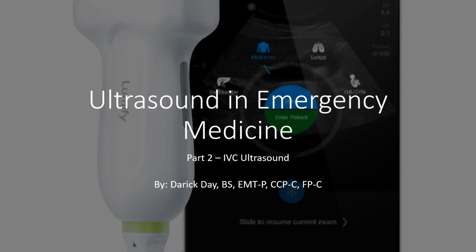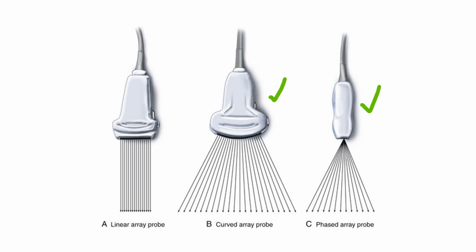Okay, so this video will be the shortest of the point of care ultrasound videos. We're going to go over performing a basic IVC ultrasound and how we can utilize that in our sick patients. For this one, we're going to want to do phased array or curvilinear. IVC obviously is deep, so we want one of the low frequency probes. If you were doing this on a child, you could maybe get away with that linear probe.